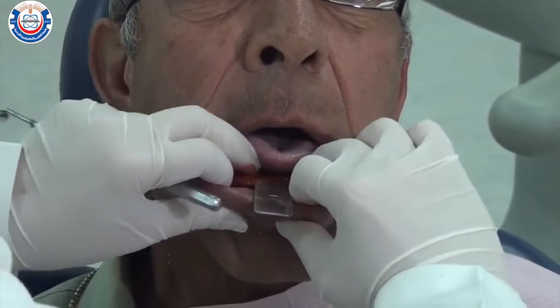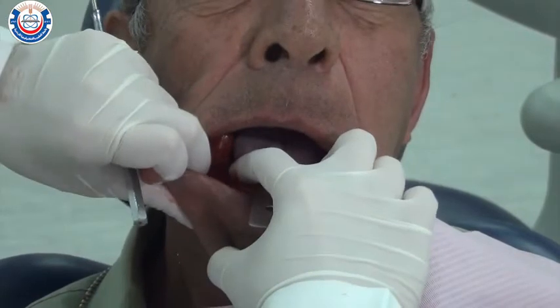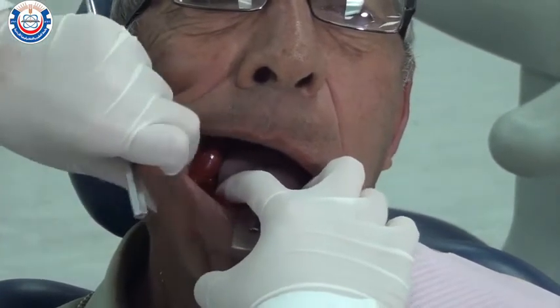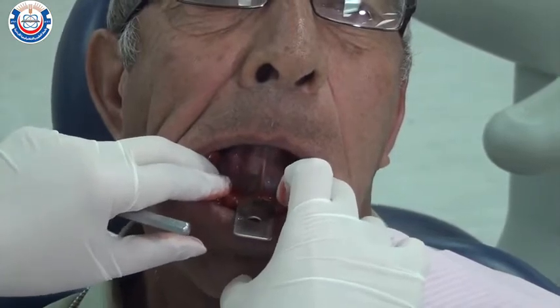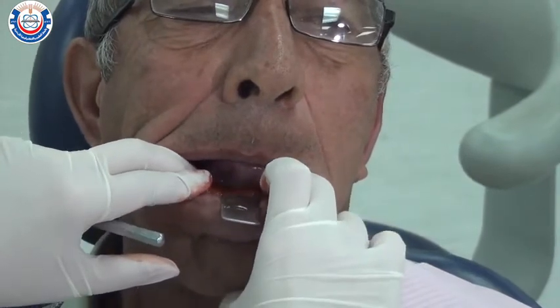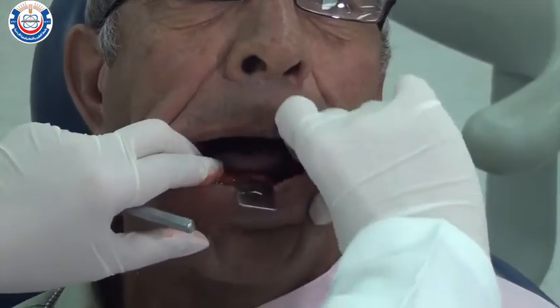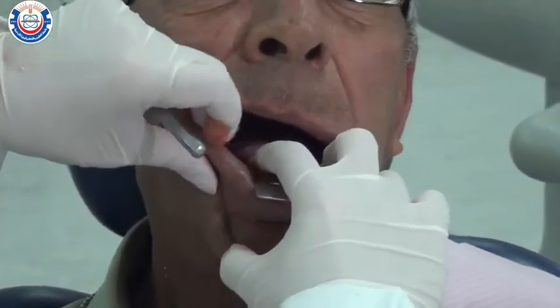Gently border mold the peripheries by stretching the cheeks and the lips around the edges of the tray. Ask the patient to protrude their tongue and move it right to left and swallow, as this will border mold the lingual area of the sulcus. Repeat the steps one more time while the material is still soft and hold it in place until it reaches mouth temperature.